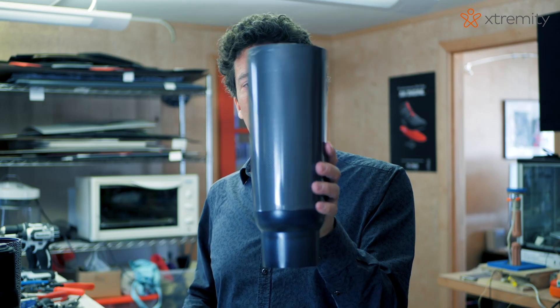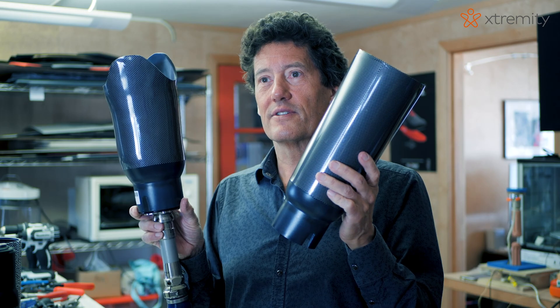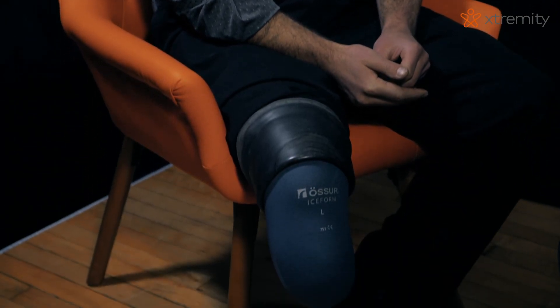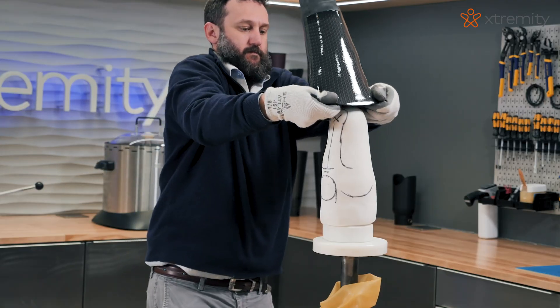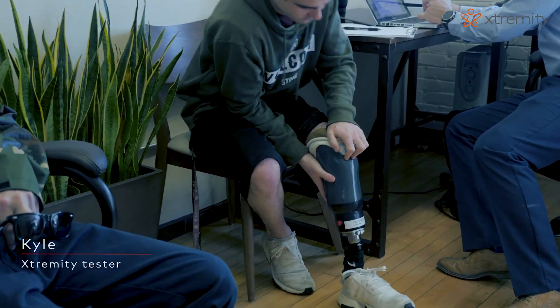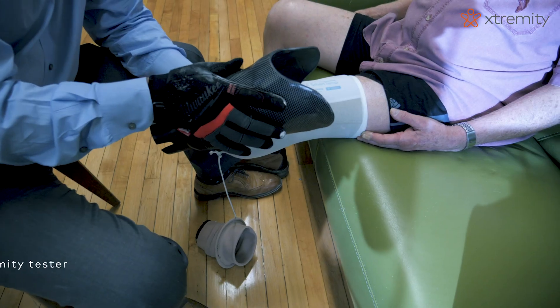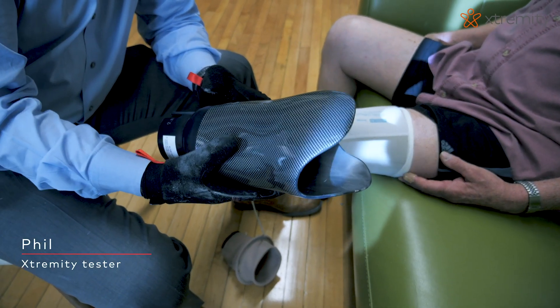Here's the injection molded socket as it comes out to the practitioner, and here's the finished product. This took less than an hour to do, start to finish. Coming in for an hour appointment and getting it fit and walking out that same day — that's so beneficial to me, just to eliminate that wait time. It takes the shape of the limb so accurately and so easily, it's just incredible. The way it fits, it feels like it fits so much better than my actual socket.